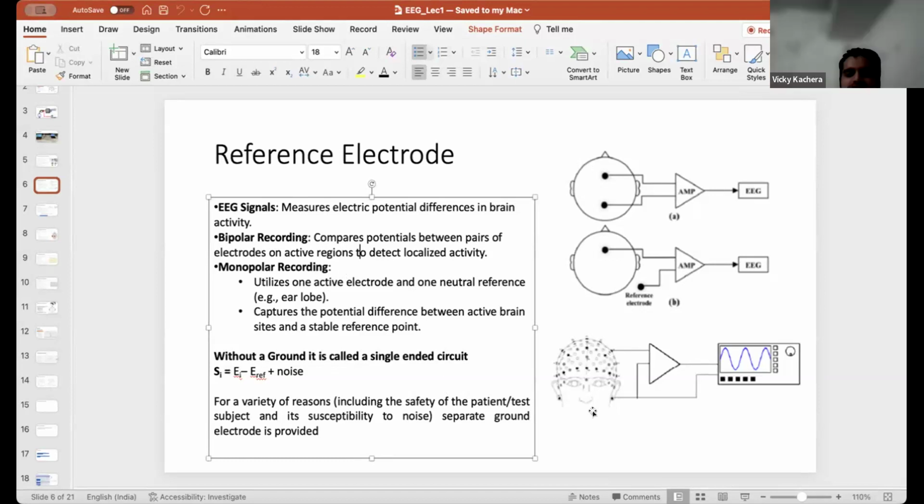So we use monopolar, right, ma'am? Yes, I think so. You can also check with Rahul or Nitesh, because I tried to see, and it mentioned a single FPZ. Otherwise it should be double if it is bipolar. There are also weird caps in which there's a difference between these two, then between these two, and several different types of systematic bipolar differences. What we use is a single reference, and the differences between each electrode and that single reference.